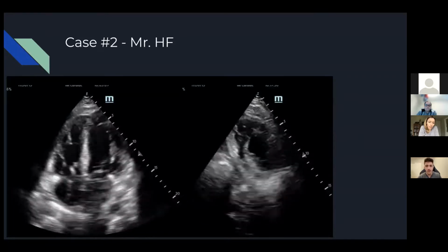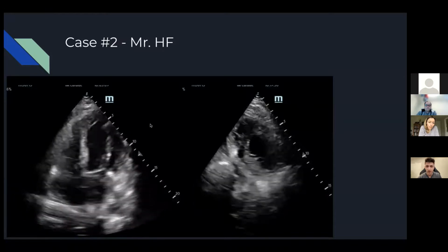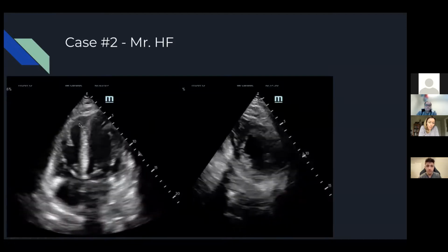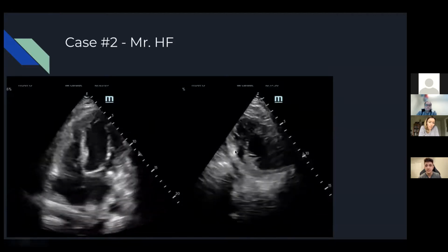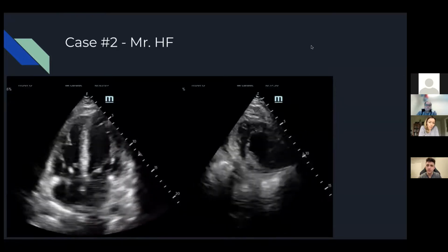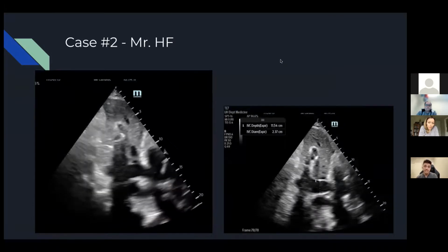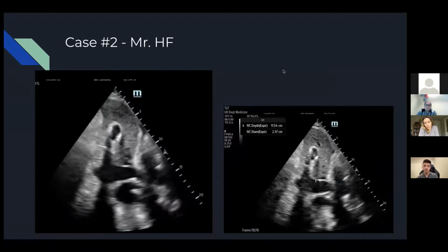So I just wanted to quickly show his heart scans here. Similar to what that echo had shown for him, his HFmEF, he's got a little bit of reduced ejection fraction here, probably, or systolic function. The RV looks reasonably crisp, is moving quite well, doesn't look particularly dilated. He might have some regional wall motion abnormalities, but now let's move towards his VExUS. So his IVC, as you can see here, looks quite plethoric and measured as 2.37 centimeters.